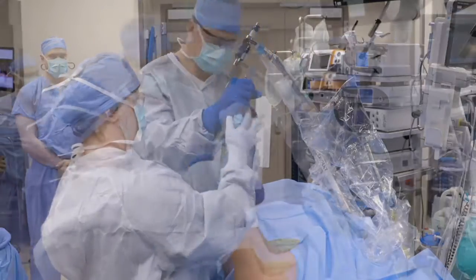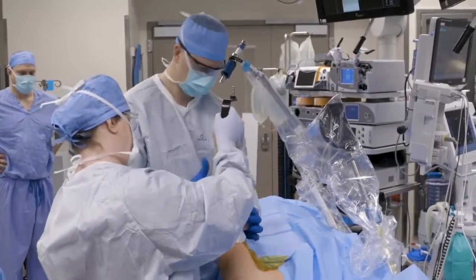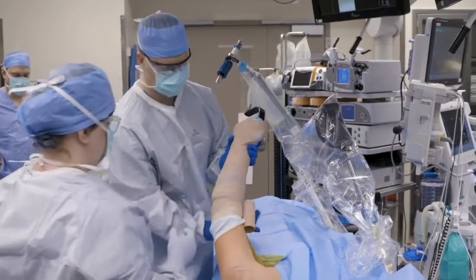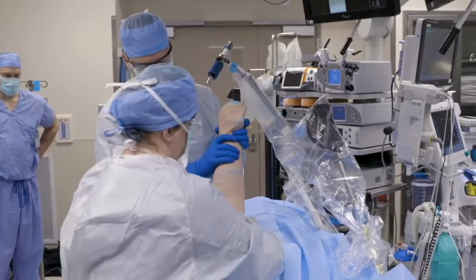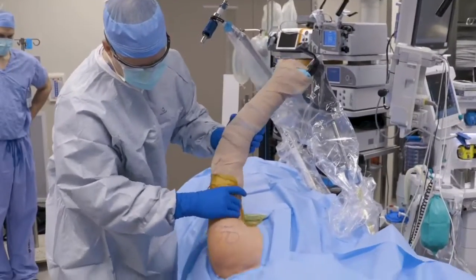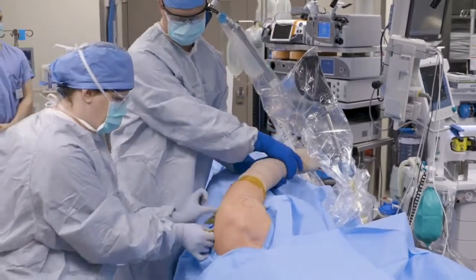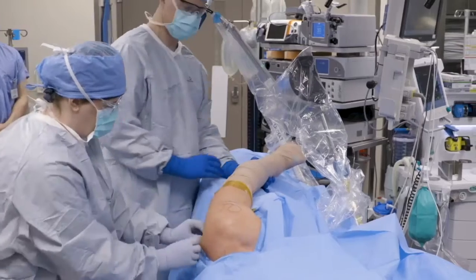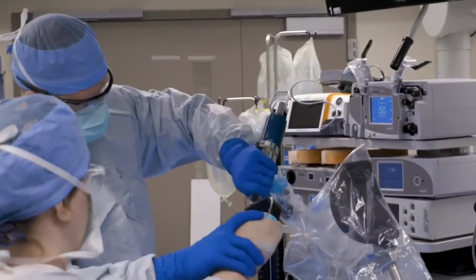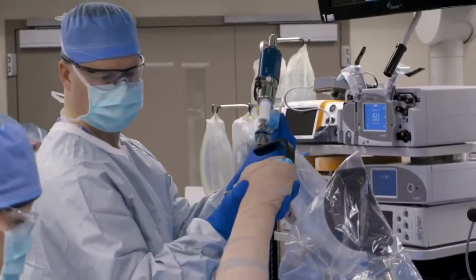The finger strap is then applied in a tight and secure fashion. The arm is wrapped very securely in coban. The coban covers the entire arm holder, stockinette, and extends to cover the skin of the patient. This is all done in an attempt to minimize slippage. The exam under anesthesia is then repeated. The edges of the drape are prepped out with sterile ioban. The arm is placed in the mechanical arm holder, secured, and then traction is applied in a distal and anterior direction.